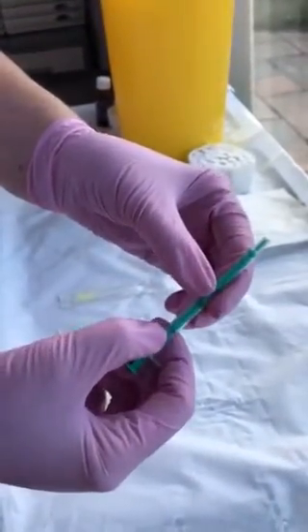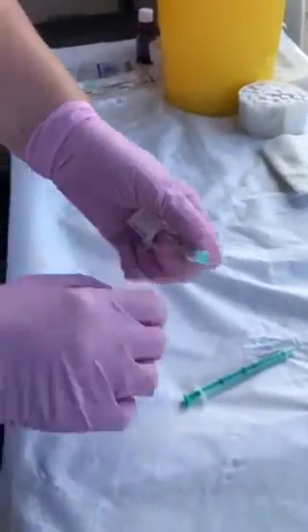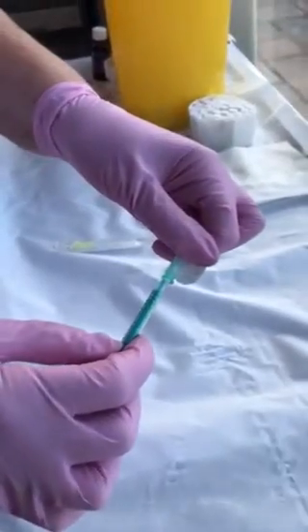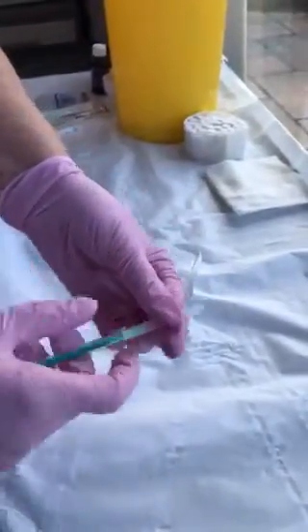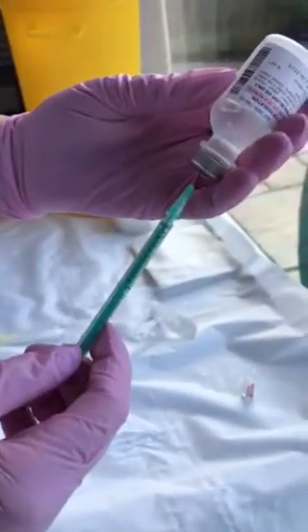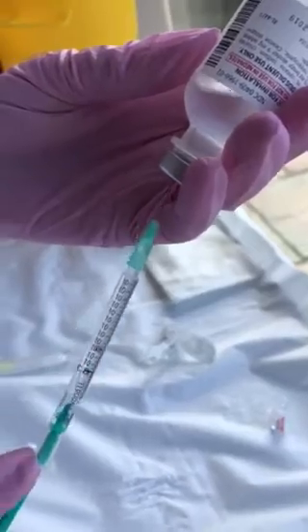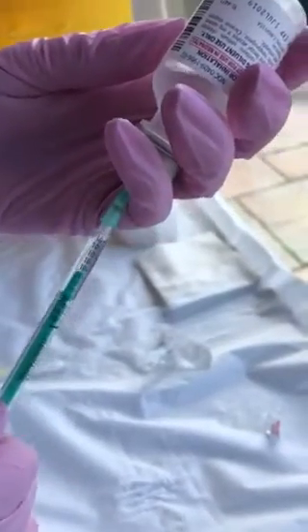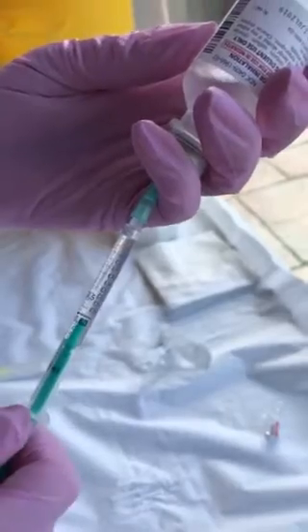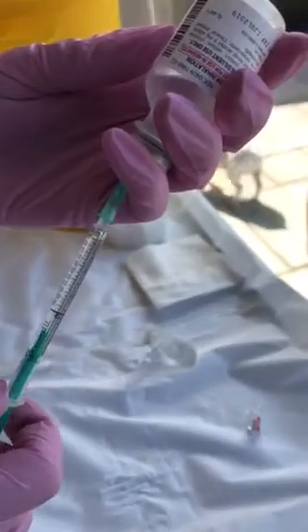You can see it's a 1 mil syringe — it says it just there. I'm going to use a 21-gauge needle to draw up, which is your green needle. Place it on ready and then you're going to draw up 1 mil. Okay, so you've got 1 mil of saline there.